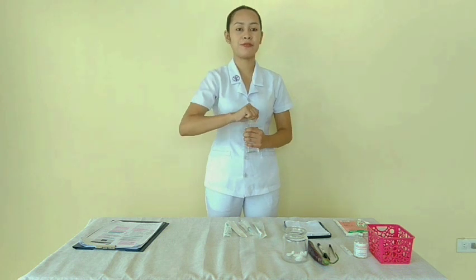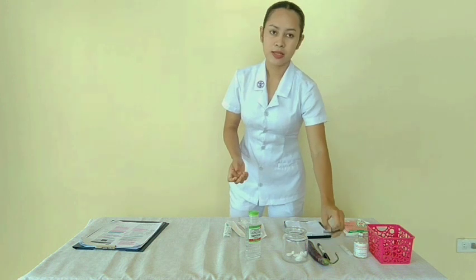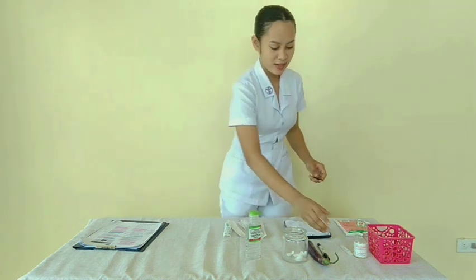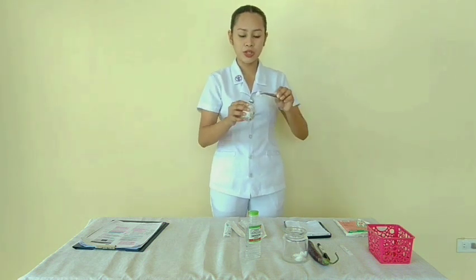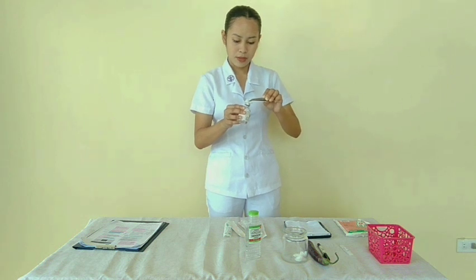So I'm now going to proceed with preparing the medication. But before that I'm going to perform hand hygiene and observe appropriate infection prevention procedures. So prepare the medication vial for withdrawing and clean the top of the vial with a cotton ball soaked in 70% alcohol. Clean it in a circular motion to ensure its sterility. Then discard.